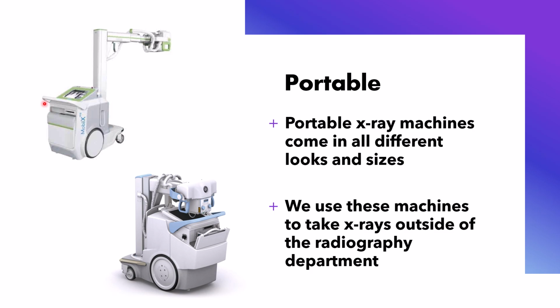The portable X-ray machine, I won't say much about that. It's one that you can move. It's sometimes called a mobile unit or a portable unit. We use these when we need to take images in a patient's room or where we don't have a machine set up. Most of the modern ones now are DR, they use the DR plate, and you'll see the image here on the machine.